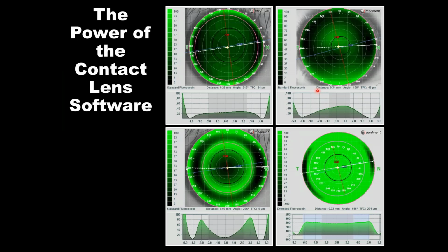Now, the contact lens software is this incredible tool that we've been discussing, and this session won't go into great detail on using the contact lens software, but I wanted to encourage you to use some of the things we've discussed. Use that customized composite capture to create that large view of the eye and then take that to the contact lens software. If you're building an Ortho-K lens, take that optimized composite capture, convert it to the ideal eye, then build your orthokeratology lens.